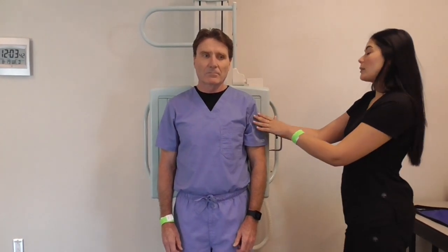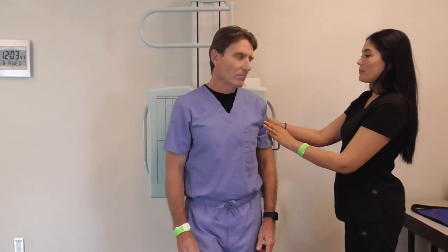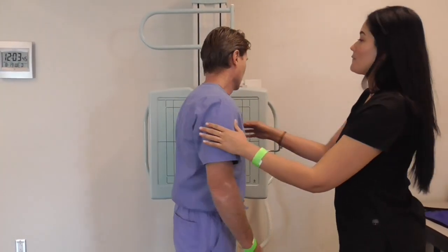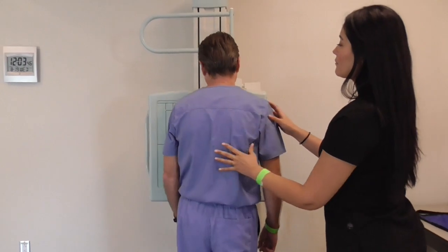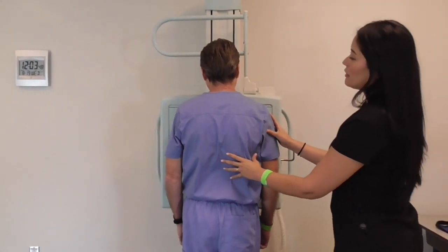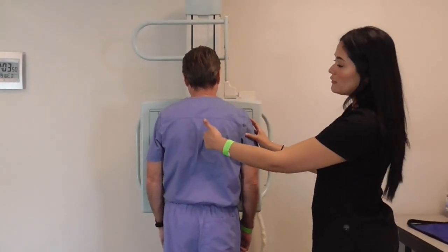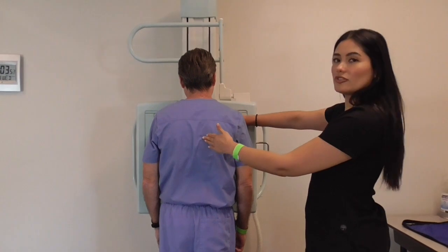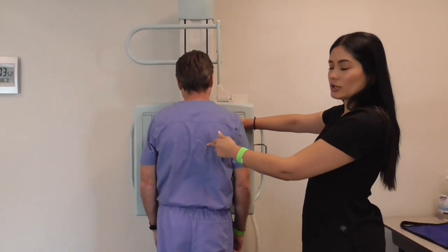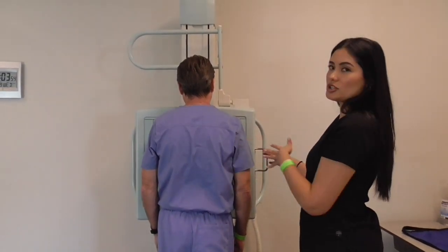And I'll be demonstrating a PA projection. So I'm going to have you face the board. So now it's coming posterior to anterior. This is a PA projection.